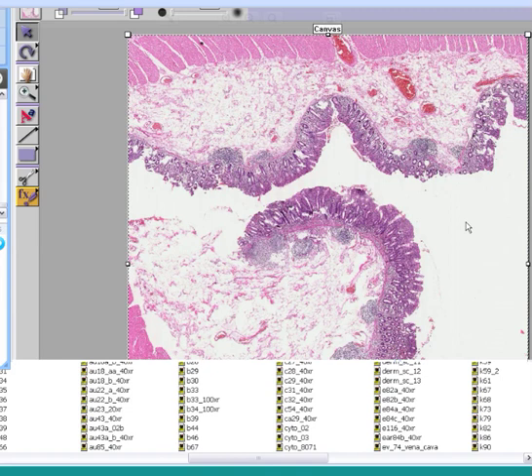You could possibly get it confused with the pyloric portion of a stomach, theoretically speaking, but it's a classical large bowel. So you have your mucosa, you have your loose submucosa, you have vessels in the submucosa, you have a lot of smooth muscle, and it's not thick enough. The slide is not big enough to actually see the serosa or adventitia, depending on what part of the colon it is.